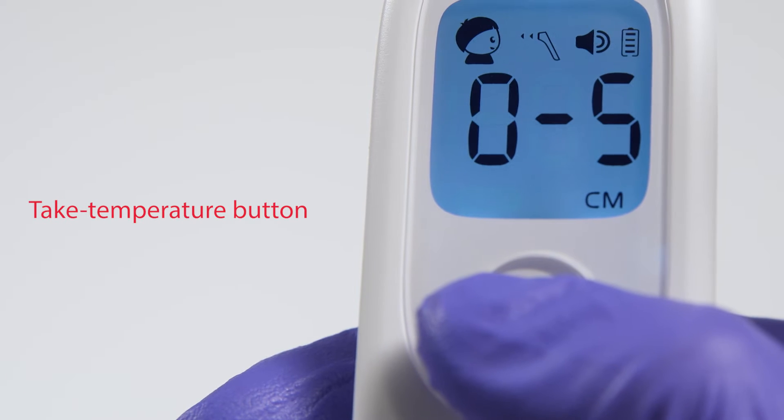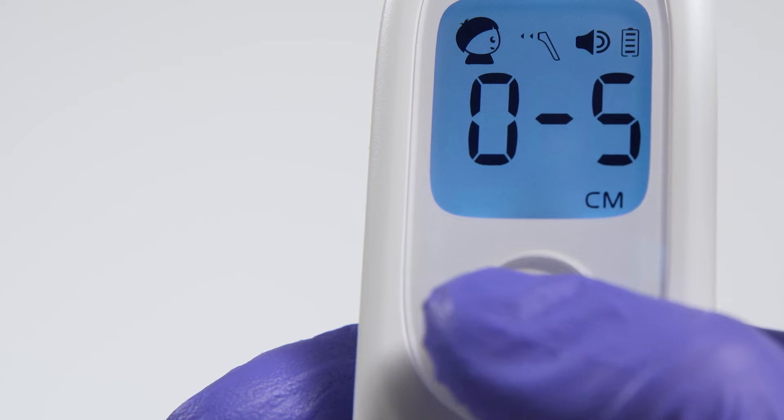We'll start by powering on the thermometer by tapping the main Take Temperature button. Now let's look at some of the features of the device.